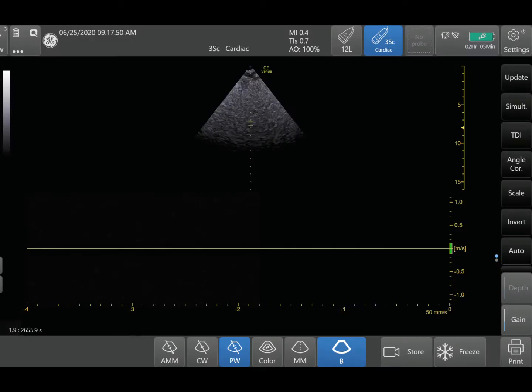In this video I want to go over some Doppler settings that are a little bit more uncommon but you may encounter them and need to know how to use them in certain circumstances. The three things we're going to cover are wall filter, steer, and angle correction. These are a little bit more uncommon but you may need to use them when you're in a pinch.